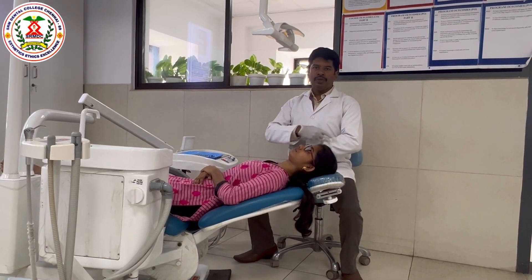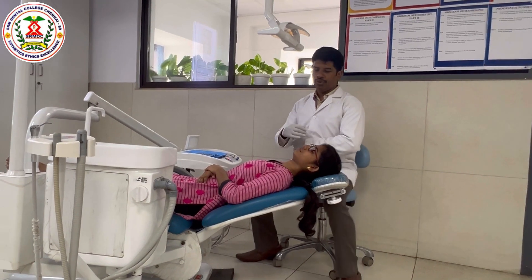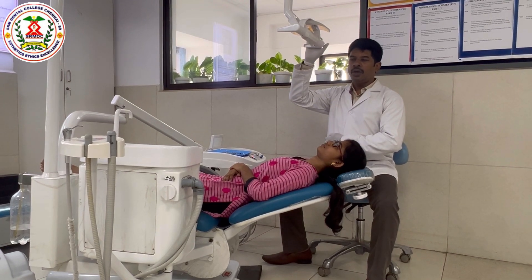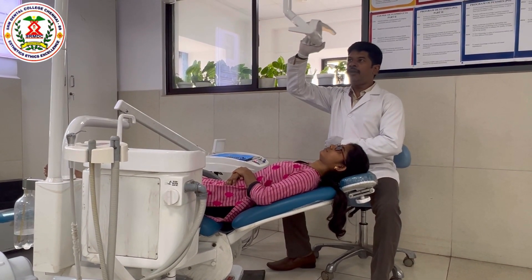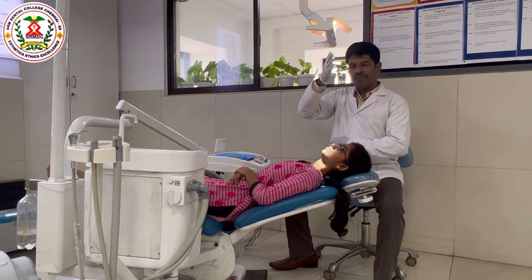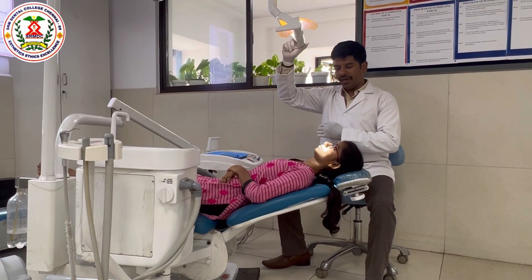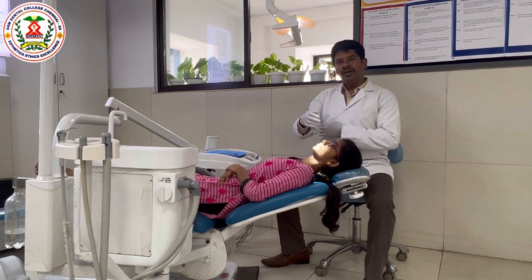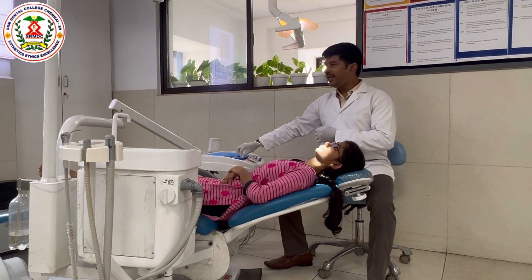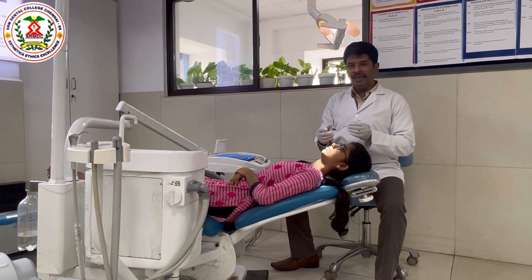As you can observe now, the patient is below my elbow — this is the main principle to position the patient. This is called the V1 position. For the mandible, we keep the light at 90 degrees to the mandible. For the maxilla, you keep the light at 90 degrees to the chest and angle it toward the hand, so it goes at an angle to the maxilla. This eliminates any shadow when you are doing the dental procedures. So 90 degrees to the mandible always gives illumination without shadow.